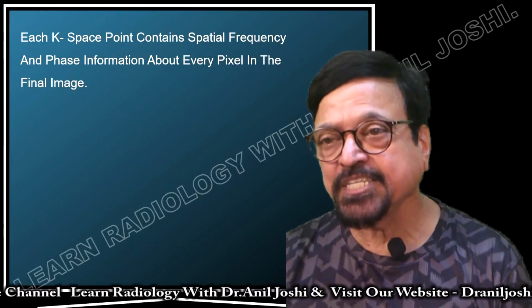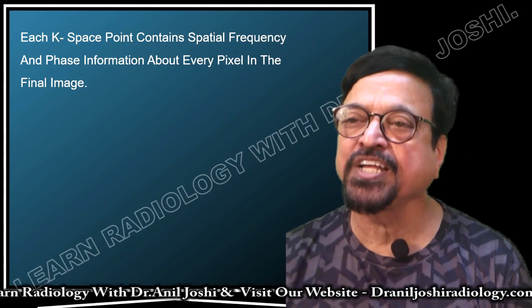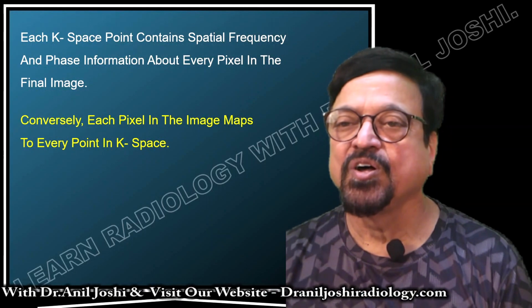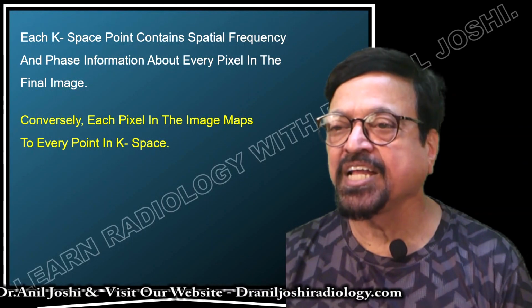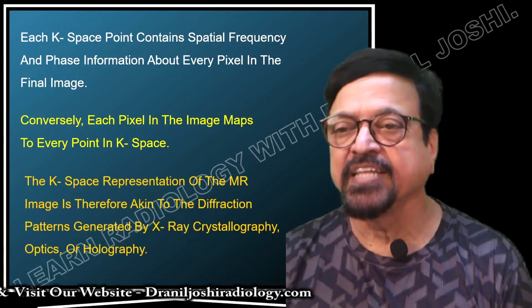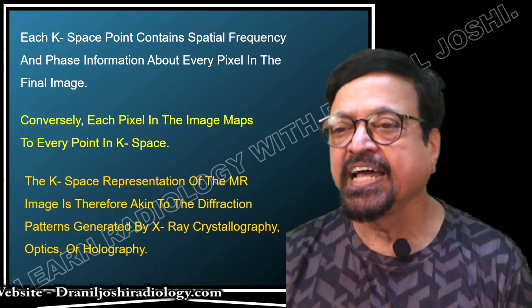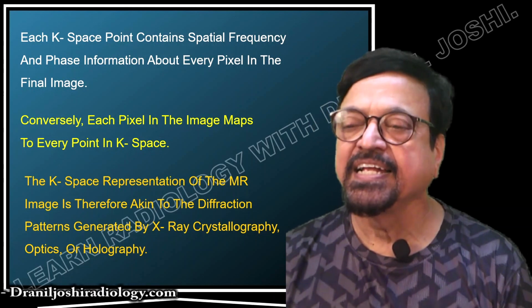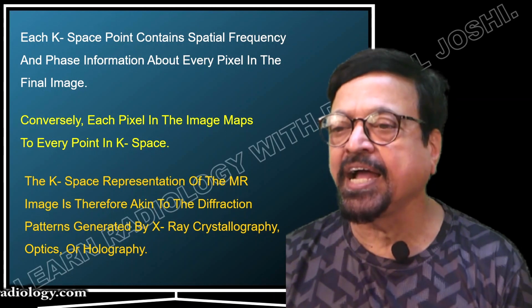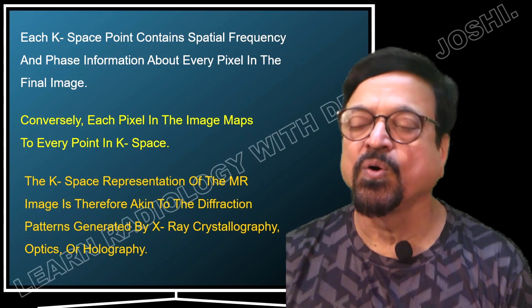Each k-space point contains spatial frequency and phase information about every pixel in the final image. Conversely, each pixel in the image maps to every point in k-space. The k-space representation of the MR image is therefore akin to the diffraction pattern generated by X-ray crystallography, optics or holography.